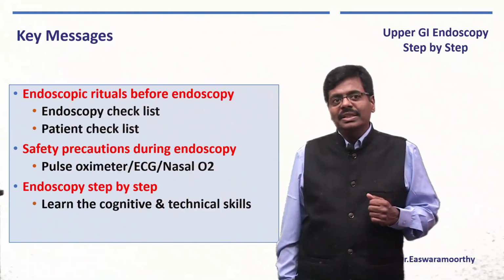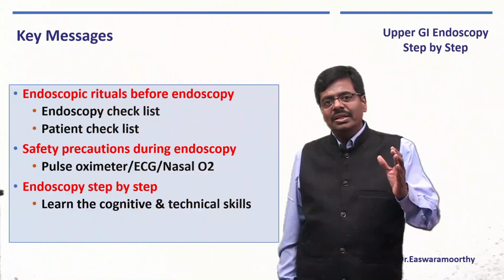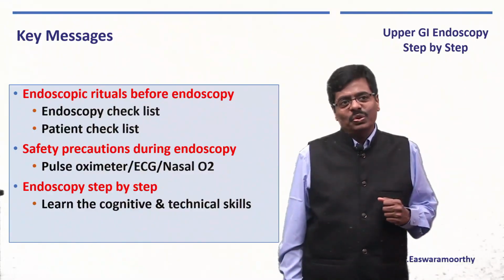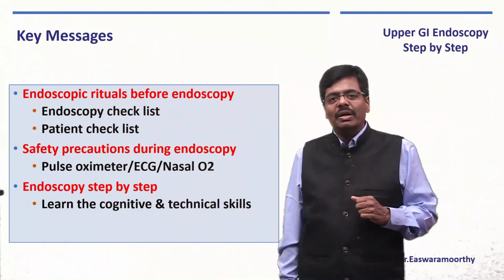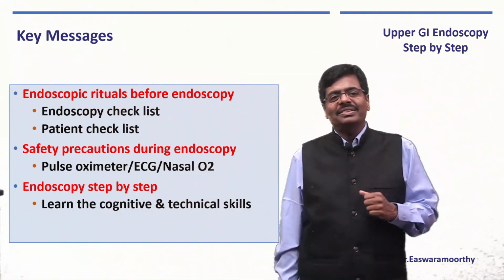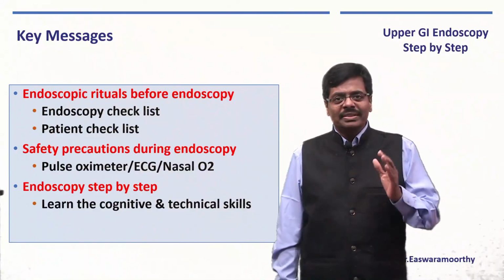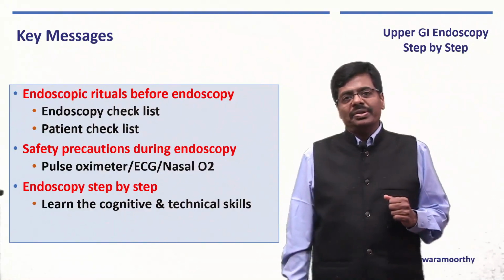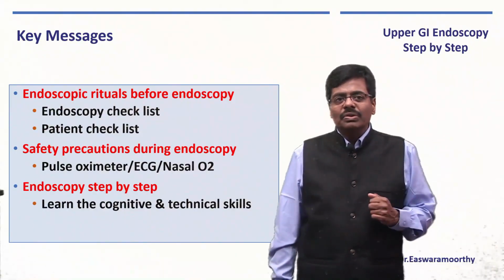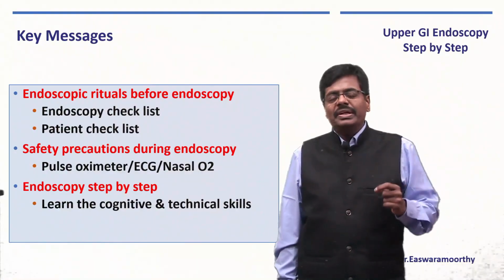So, ladies and gentlemen, as I just said, this is just a beginning of your journey to perfect the art of endoscopy. So, endoscopy ritual is very important before you embark on any basic diagnostic endoscopy, both the endoscopy checklist and patient checklist. Second thing is, during the procedure, ensure all the safety precautions are observed with a pulse oximeter, ECG, and administer nasal oxygen.